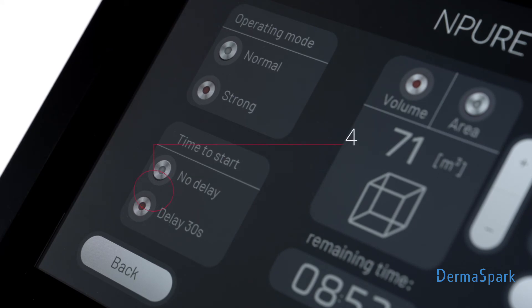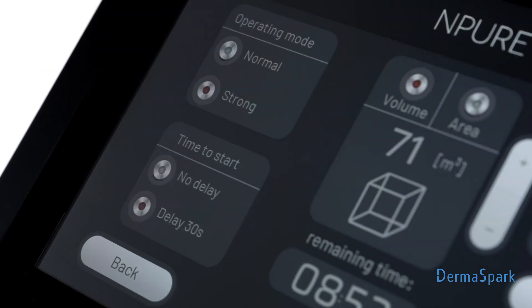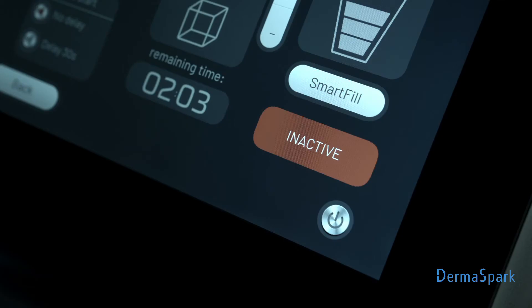Step 4: Select the time required to leave the room. Activate the device by touching the ON button.